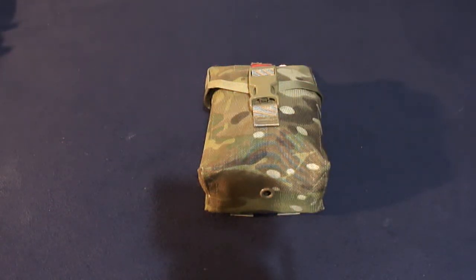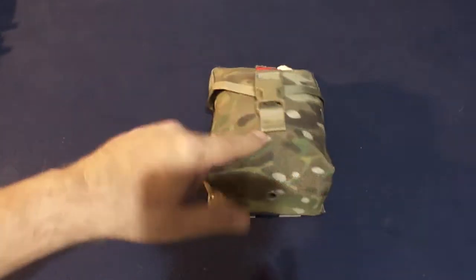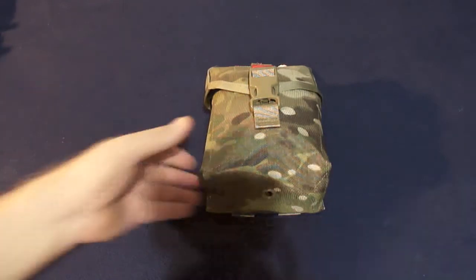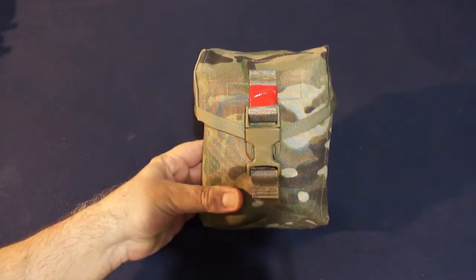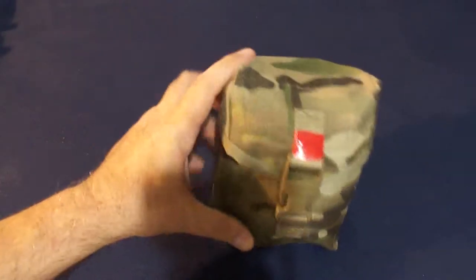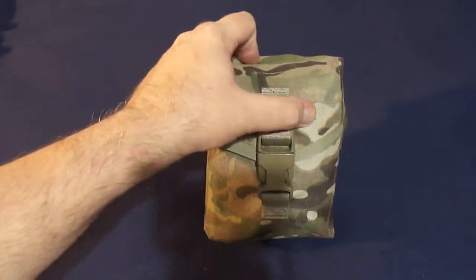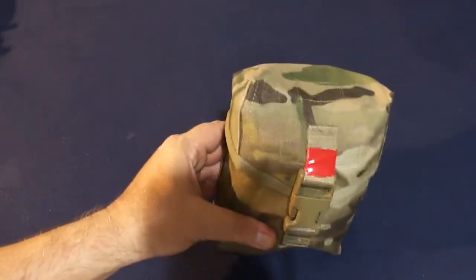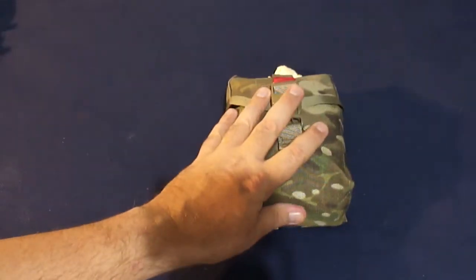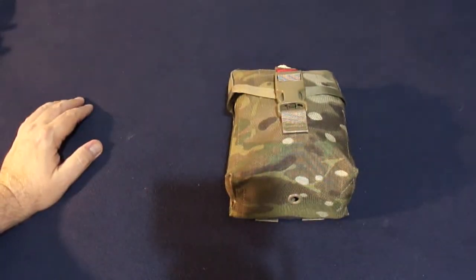I wanted to make a separate video discussing the IFAC, the individual first-aid kit. There are many different varieties; this one is based off of the 100-round SAW pouch loosely. It's got an internal velcro flap and right now is just packed to the gills with supplies.